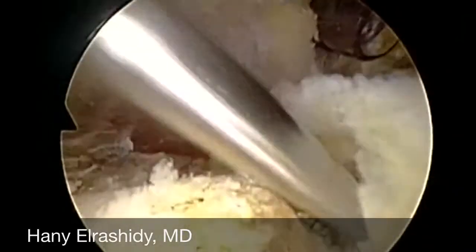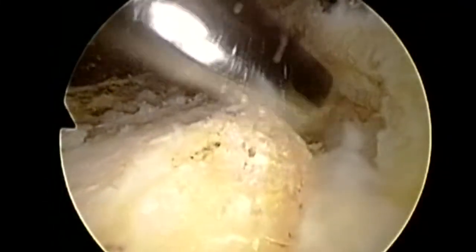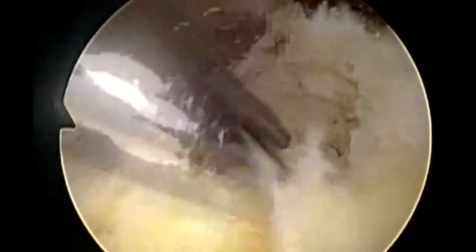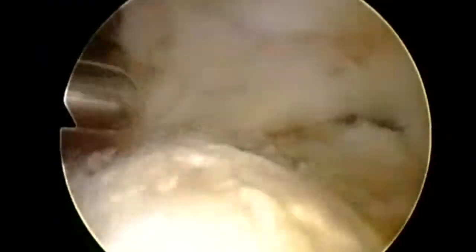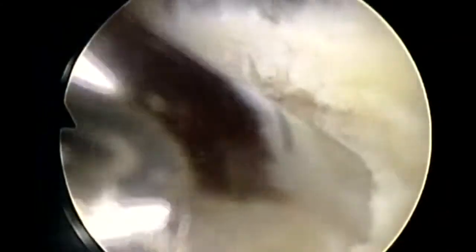This is a short clip of an arthroscopic rotator cuff repair. We'll begin with all rotator cuff repairs. Very important to mobilize the tissue. We're using a soft tissue elevator first and then an arthroscopic shaver to both mobilize the tissue, prepare the tissue, and to prepare the tuberosity, the anatomic rotator cuff insertion point for repair.